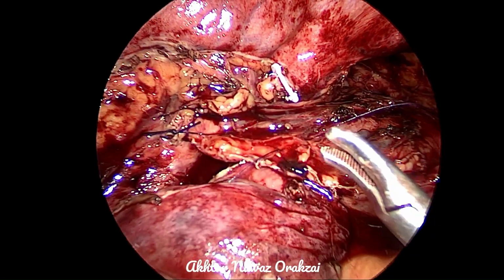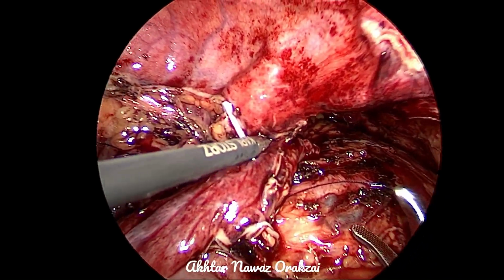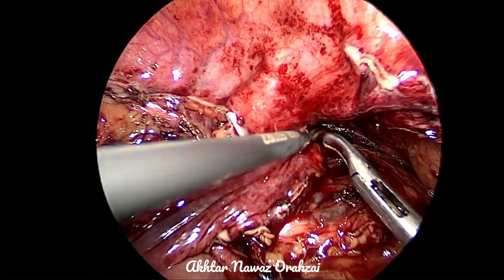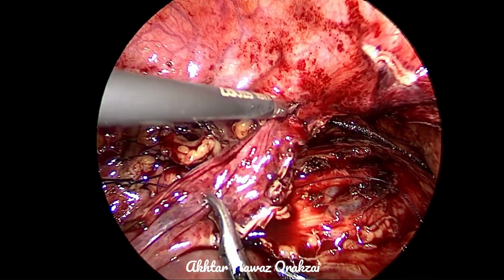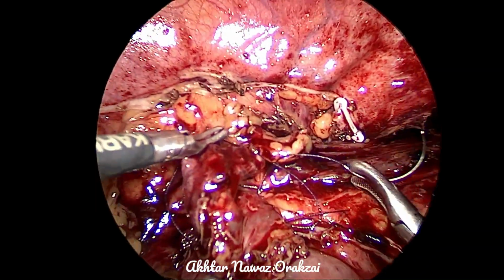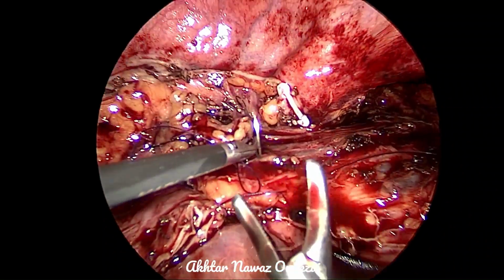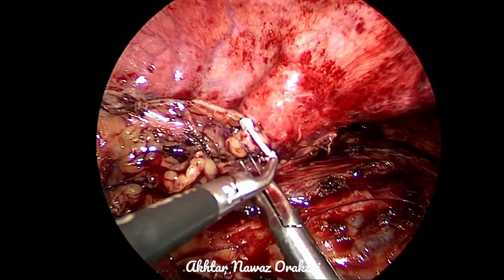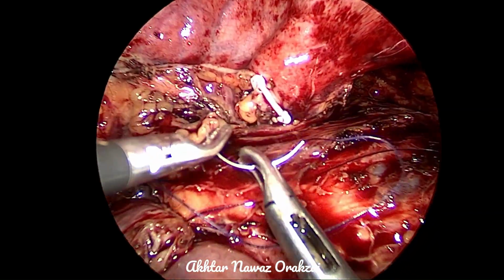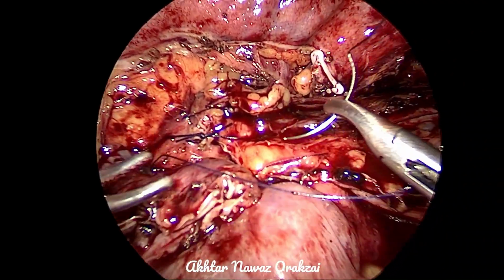An additional stitch is taken to fix the ureter to the bladder, so that the anastomosis becomes easy. So we plan on a site here to apply a stitch to the ureteric wall. So this will add to additional safety, so that when the bladder is empty, there will be no tension on the anastomotic site.